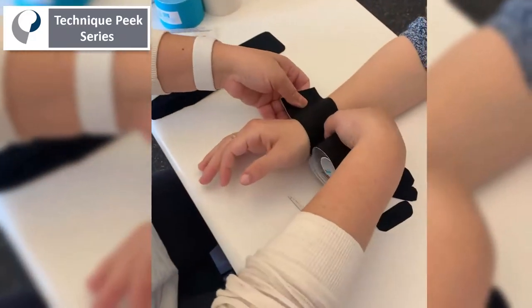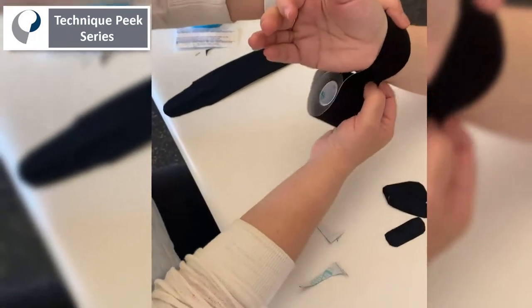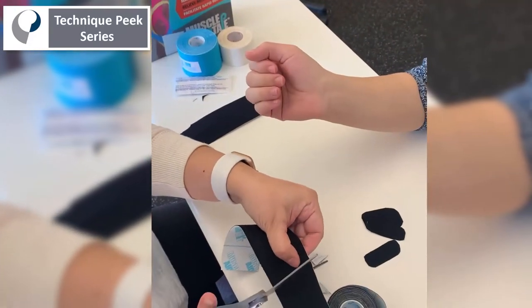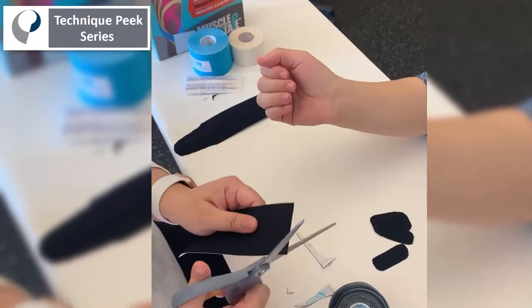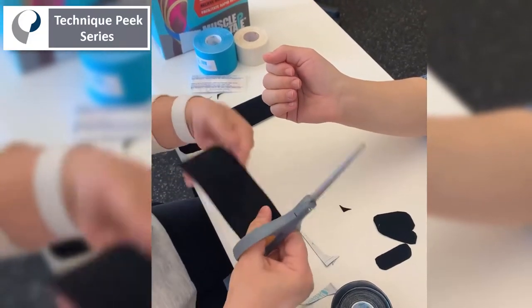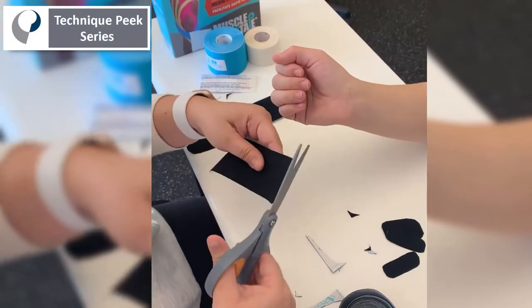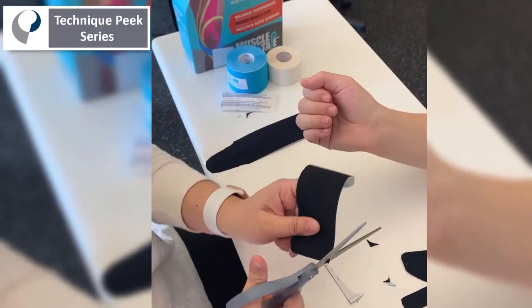One tape is on the longitudinal side along the thumb extensor muscles, and the other is circumferentially around the wrist. Rounded edges are essential throughout — all edges must be rounded.